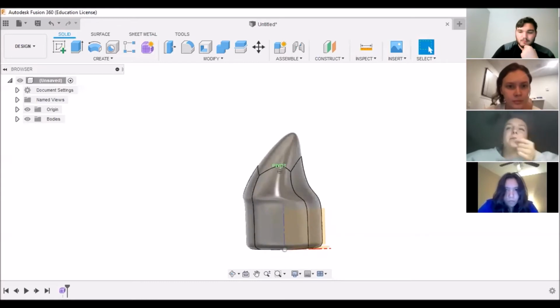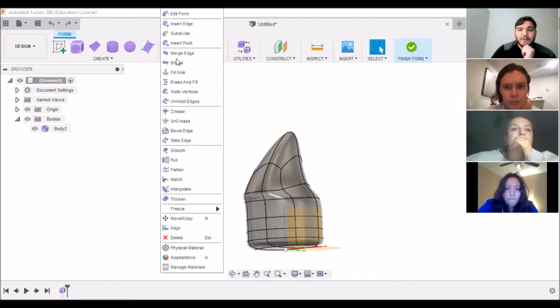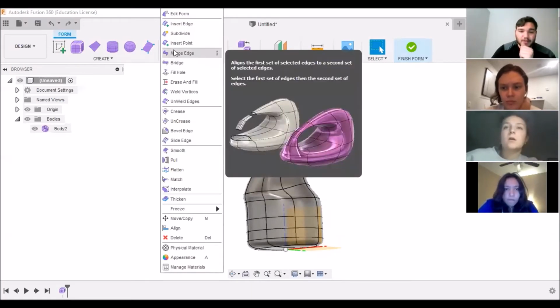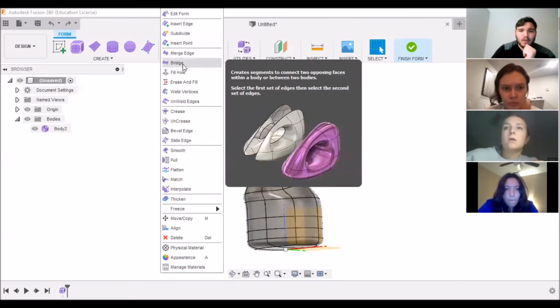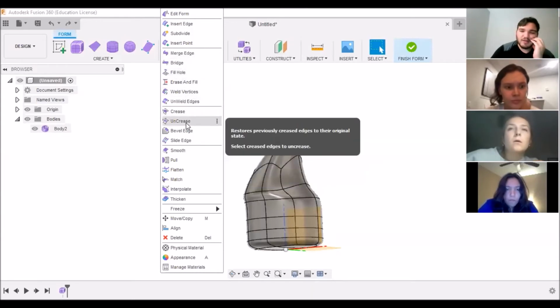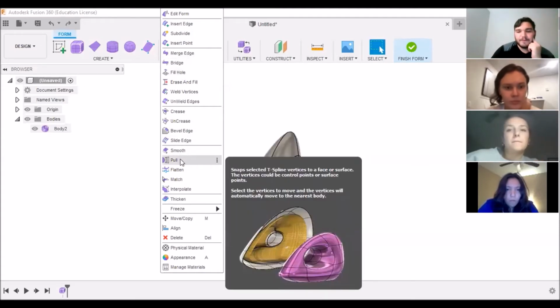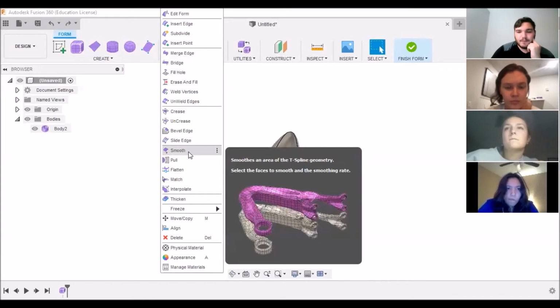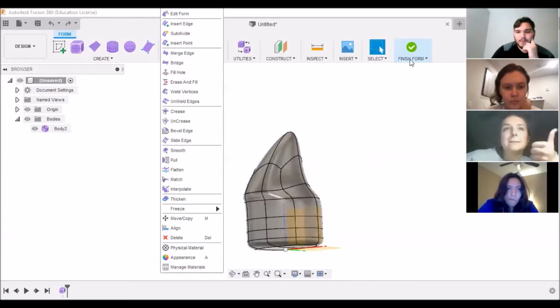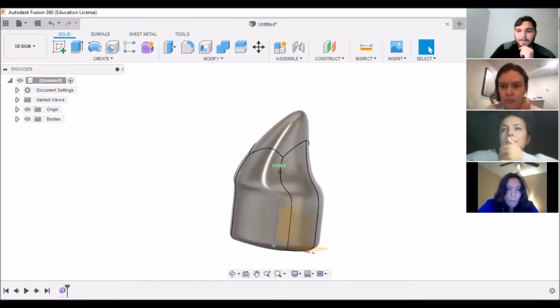Could you say where the fill hole button is? Yeah. Thank you. So fill hole is under modify. Again, just click the modify drop down. And then within, I believe, the third little window, you have fill hole. And the cool thing about this as well is it'll tell you what each thing does. So if you're ever wondering, what does uncrease do? It'll give you a brief description as well. It'll help tell you. So yeah, that's a basic little fingertip.